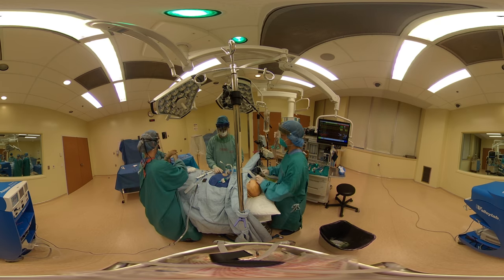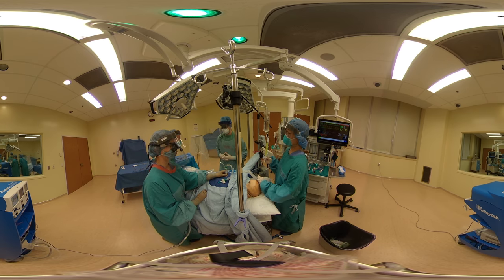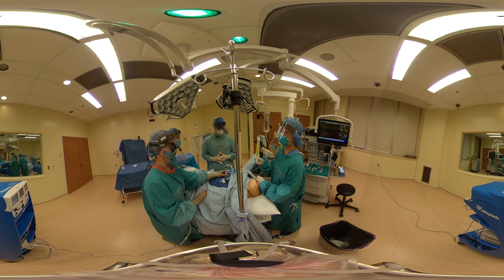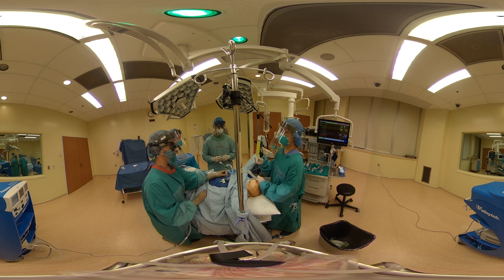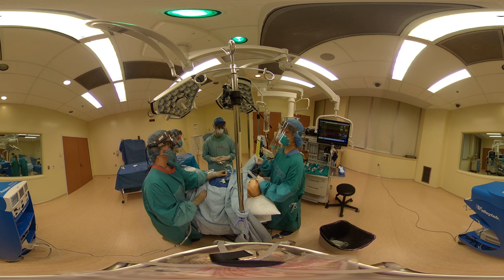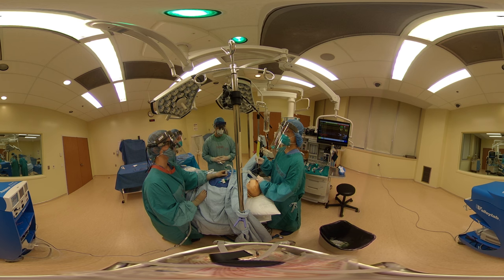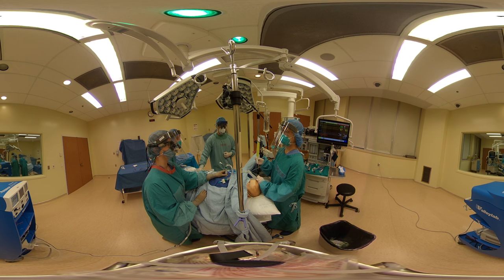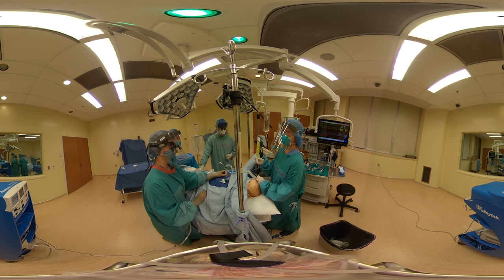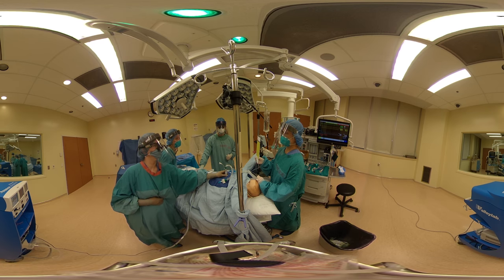Hemostasis is complete and everything's secure. We should do the debrief. We did an awake trach. The OR wound class is clean-contaminated. Counts were correct. No specimens. No equipment issues or major intraoperative events. We'll notify the patient's family afterwards. No PSLSs were filled out, no delay codes. The ID band and allergy band is still on the patient. We'll mark the time the patient leaves to start the one-hour room closure period.